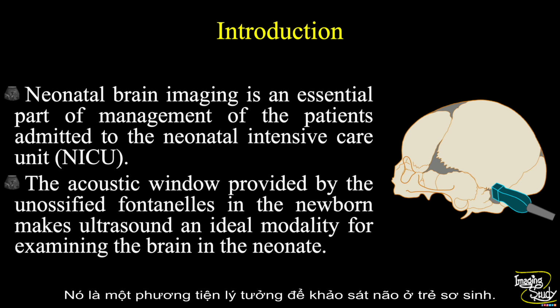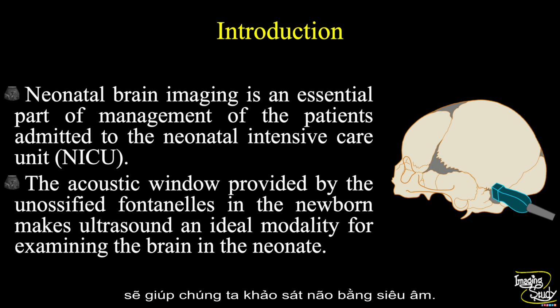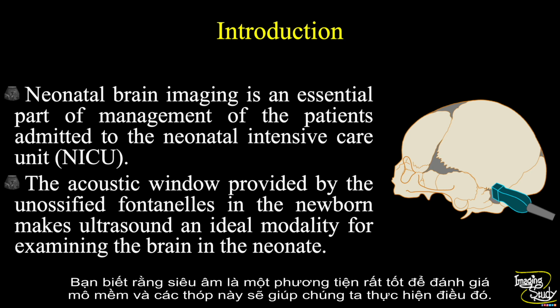It's an ideal modality for examining the brain in neonates. The acoustic window that we can get through the unossified fontanelles in newborns helps us to scan the brain with ultrasound. You know, ultrasound is a very good modality to evaluate soft tissue, and these fontanelles help us do that.